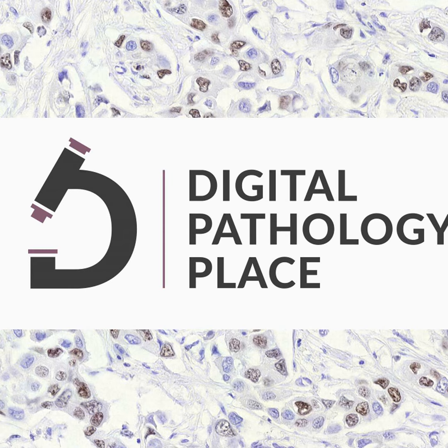The way that we typically would do this, for example, when I did my PhD, our data sets were much smaller. We would have maybe 30 patients. 30 patients is small enough that I would manually open each and every slide. I would find any artifacts in there, for example, a crack on the cover slip, tissue folding, blurriness, overstained regions that were too thickly cut, whatever it was. I would manually look at each and every single slide, and I would sit there with a digital pen and circle the regions that were good for computation, right? So that means that we'll say they're artifact free and they're of high quality.